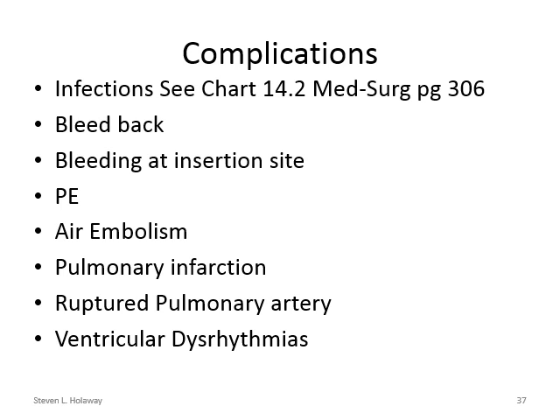So you're going to treat this as you would any other central line type process. If you look at chart 14-2 in your Lippincott Hinkle MedSurg book, it gives you a big list of things that you need to be aware of.